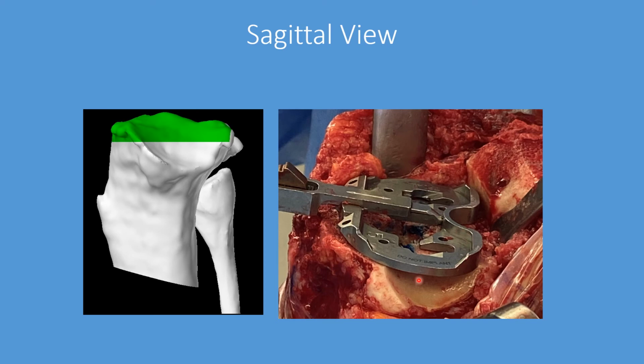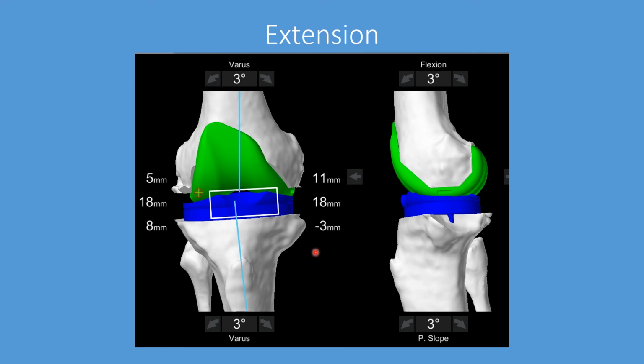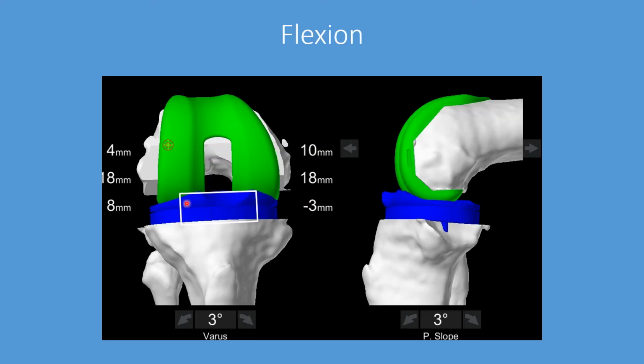And in this knee, having organic structural support is going to be much healthier than synthetic support with removal of this entire hemisphere. And then one of the best things that we can do is that we can then test our assumptions and the changes that we made. Again, we are looking for symmetry in extension and in flexion. Specifically the symmetry, 18 mm between the medial and lateral side. So before there was a wide gap, narrow gap here, and we've restored symmetry here. Knee is lined up, and we'll also do that in flexion. And we can also see that we've reproduced our flexion gap, and it's balanced, and we have 18 mm on the lateral side, 18 mm on the inside.